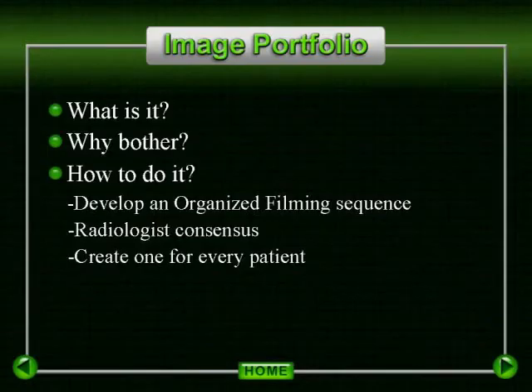We feel that it is important that with every breast MRI, the order of images presented is identical so that it becomes very easy and routine for your referring physicians to become quickly oriented and quickly review the case. This should be something that is created for every patient, not just the ones with pathology. Create it for your normal cases. Make it just part of your routine interpretation.